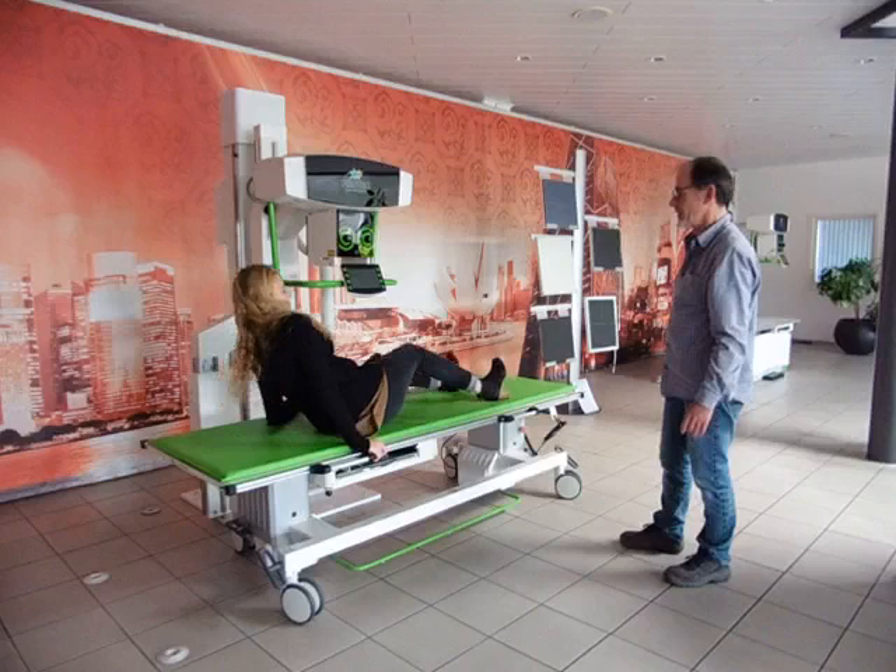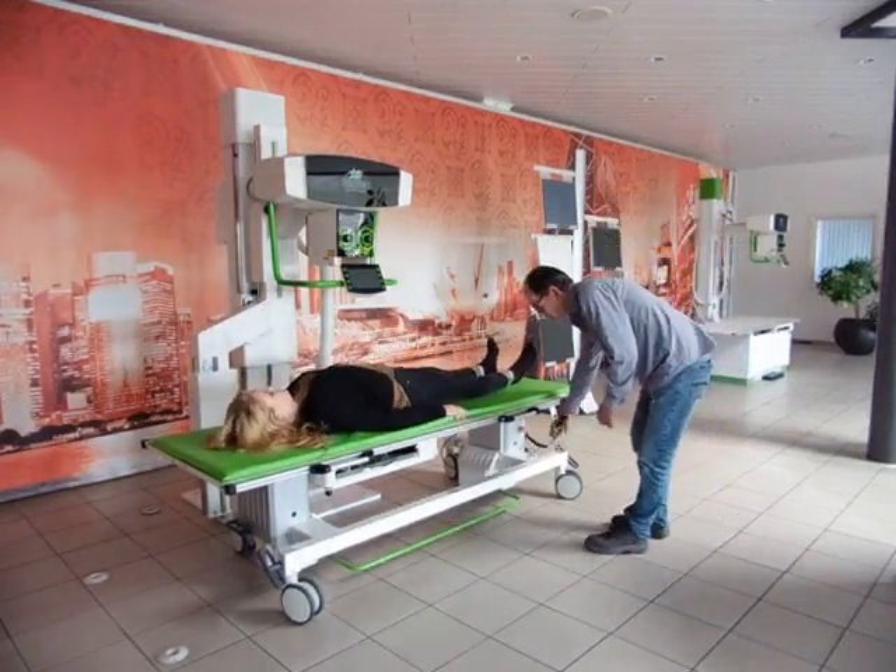You can also see the brakes are fixed on both sides and can be handled by foot on both sides as well.